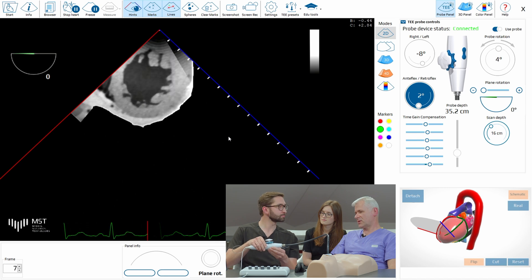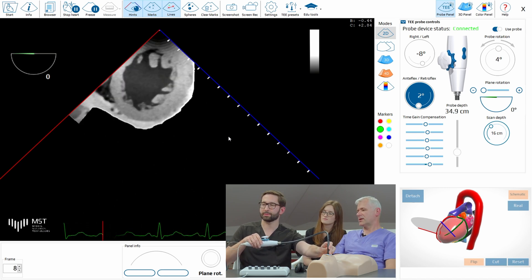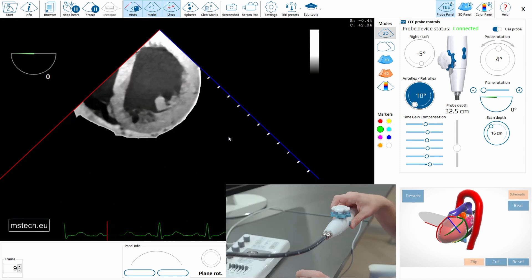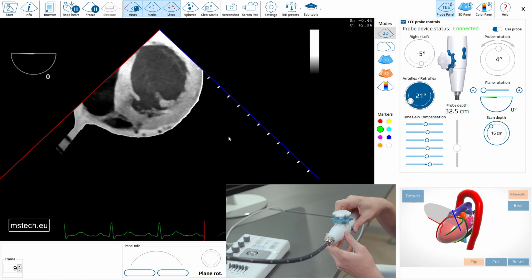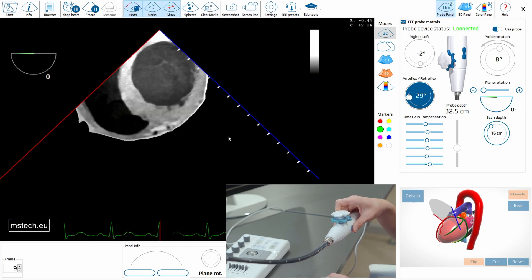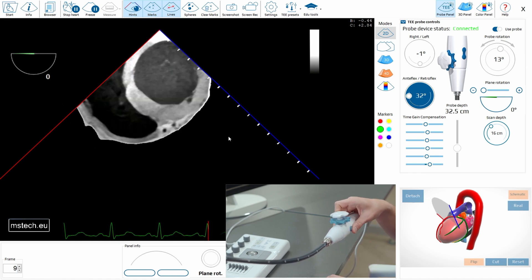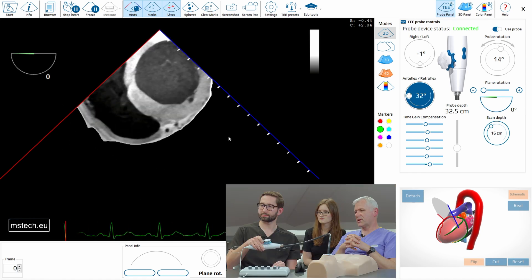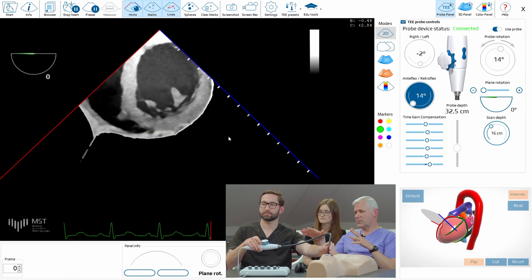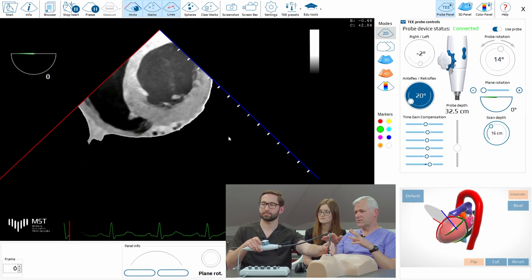So if you want to go to mitral valve level, you need to go a little bit higher. You can slightly release the flex but slowly withdraw even with a little flex. Mitral leaflets — beautiful. Put the mitral valve in the center and keep it antiflexed.